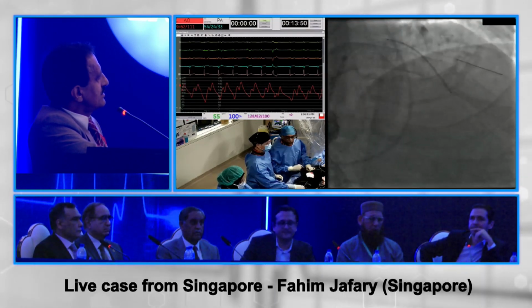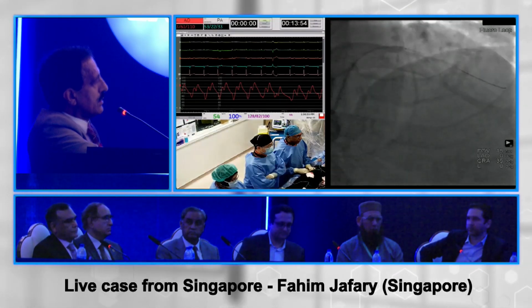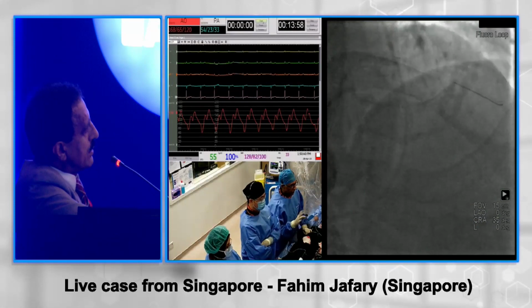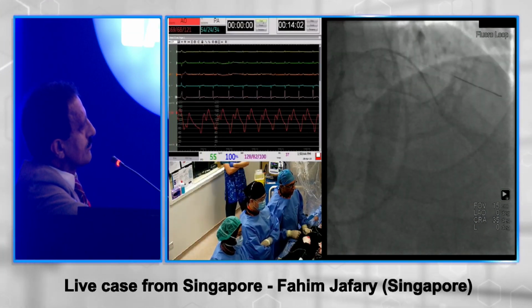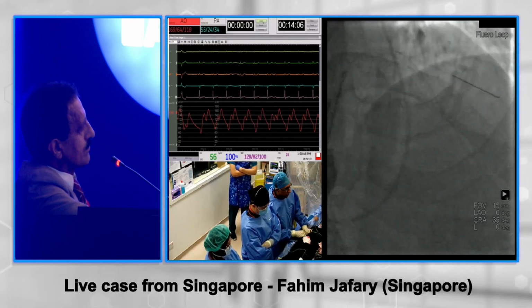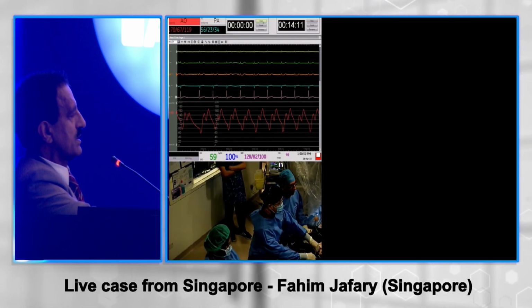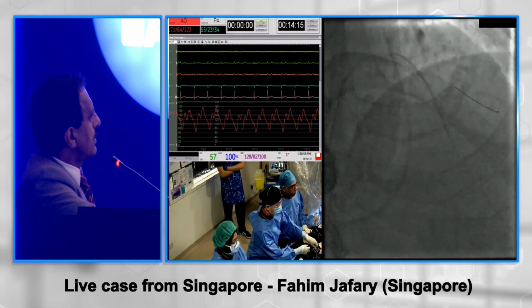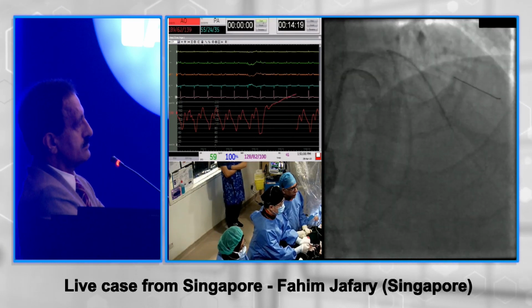Ashok, your comments? I just want to show you, this is the Synergy 3048, and if you can see it on the screen, with all the calcium and everything, it sailed right through. So I think that the XD series is very, very deliverable, compared to a previous generation of stents. So Diana tells us that we need a 3048, so I'm going to do as I'm told, and that's what we're doing.